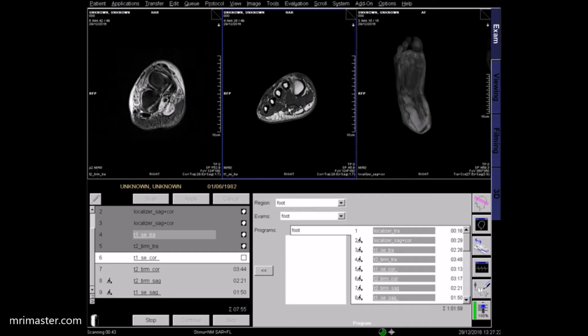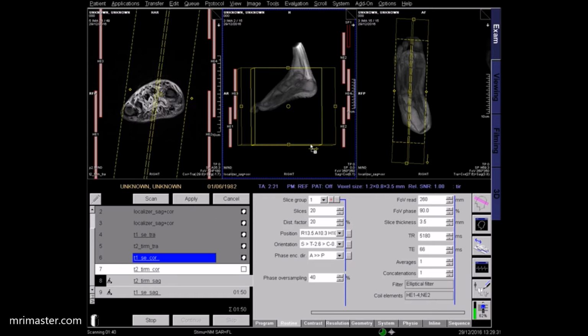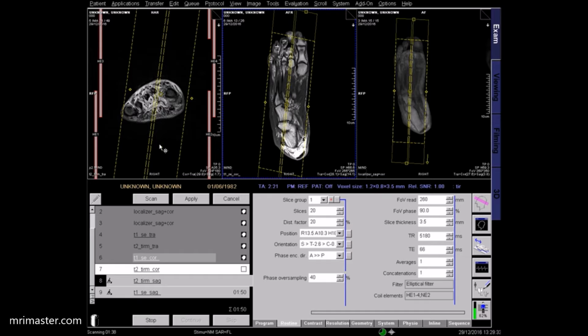This is the axial T1 image where fluids appear dark and fat appears bright. In contrast to STIR imaging, most infections and edema appear dark. Now let's plan the sagittal STIR sequence using the acquired axial and coronal images.